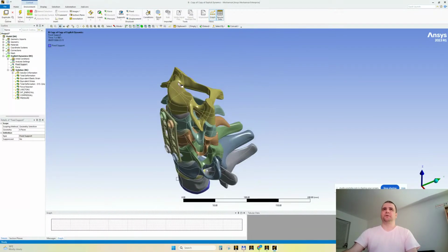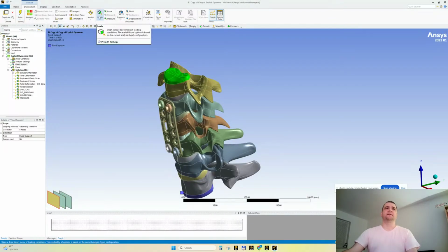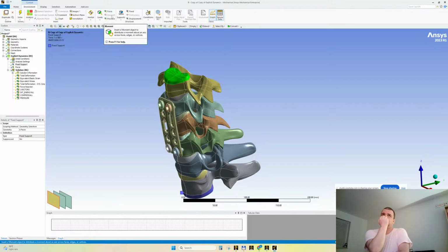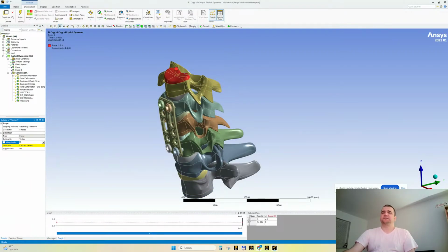And let's go here and assign the moment. Let's see if the application of the moment is as identical as they have. No, I cannot insert a moment. Oh my God, I cannot insert a moment. In Explicit Dynamics, you cannot insert a moment. I can, however, I think I can imitate a moment, maybe. So the force is, how much is the force?